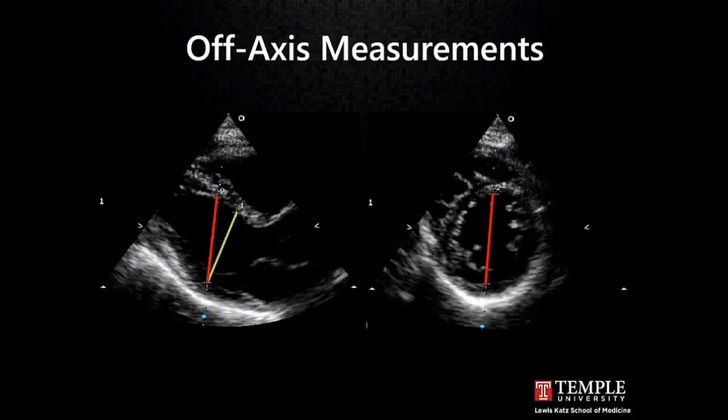So on the topic of off-axis imaging, remember that a lot of what we do in echocardiography is quantitative, and measurements are important. Dr. Keen is going to follow my talk with a talk on a number of cardiac chambers, and then Dr. Lang with chamber quantification. And this is a very key point. If you have off-axis images, you're making off-axis measurements, and you're not doing your patient a service by making inappropriate measurements. You can see the red lines identified here, where in the image where the LV long axis is too vertical, we're making an inappropriate measurement of the LV inner dimension.